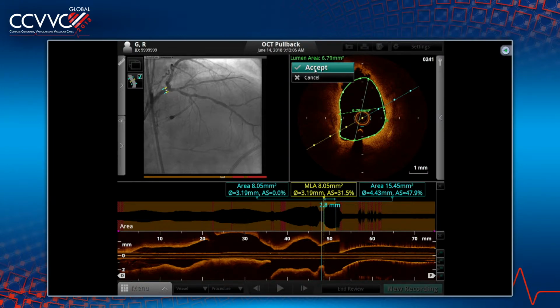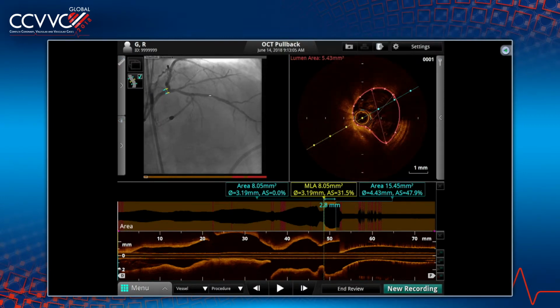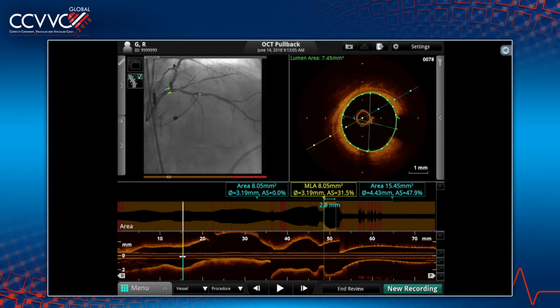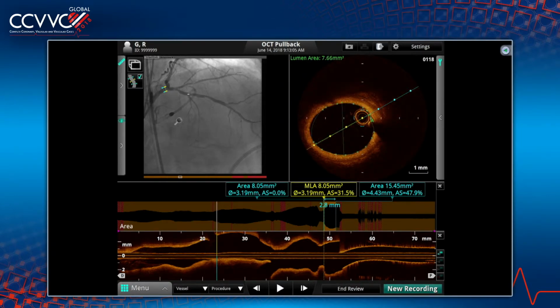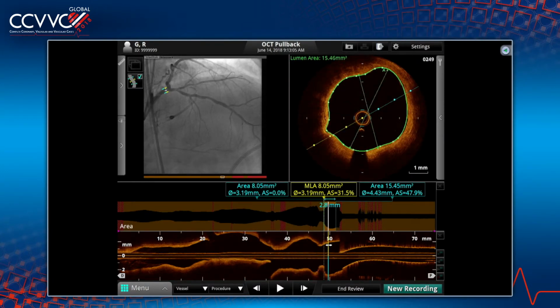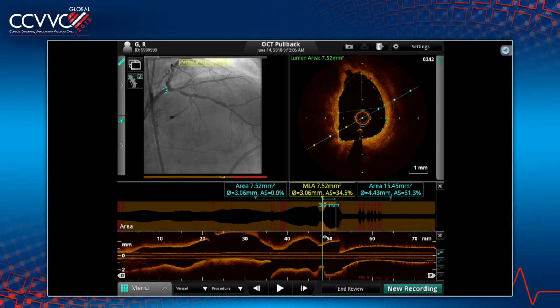Okay, let's show us the run first and show us how you're incorporating OCT into your planning or even diagnosing. Co-registration means you know exactly where the OCT is. See that? Right now coming back. Now go back. I want to see left main. What was the left main? Look at the LAD area at the bifurcation, then left main first.